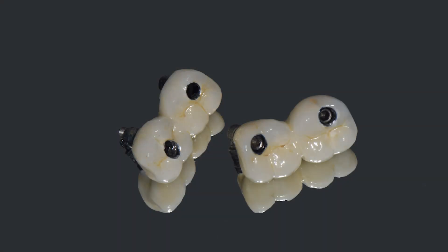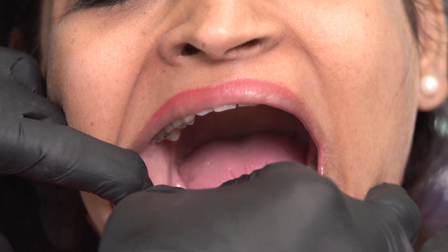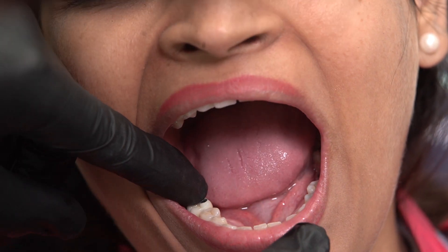The patient is back for the second visit and we have the prosthesis delivered along with the 3D printed models. This is where I now try the prosthesis inside the patient's mouth — they look absolutely perfect, nice and passive.